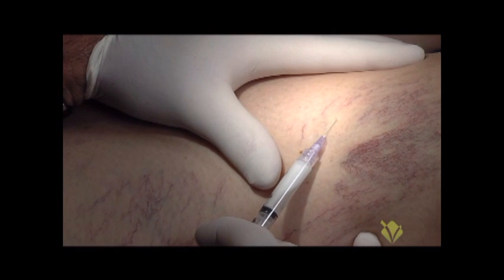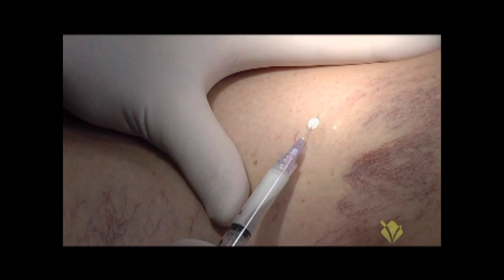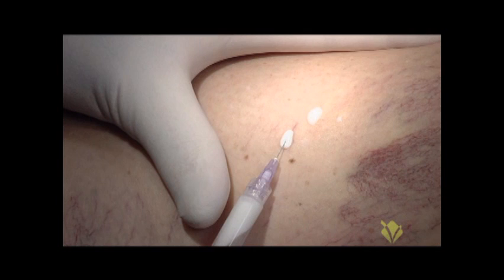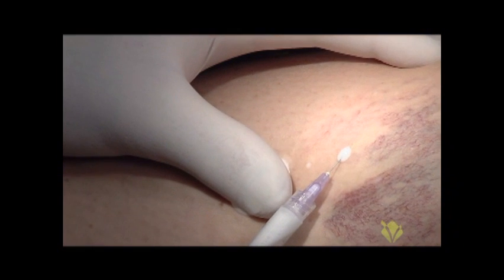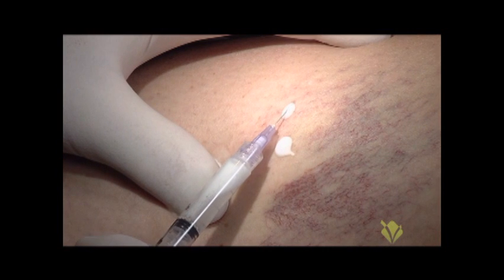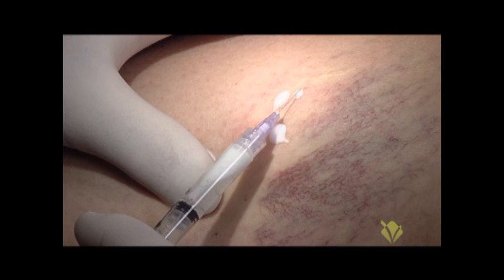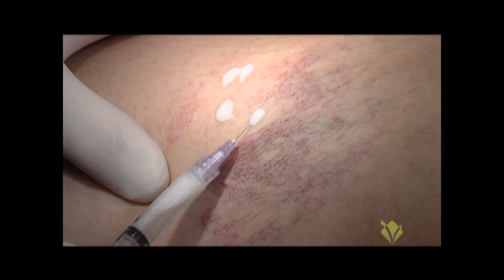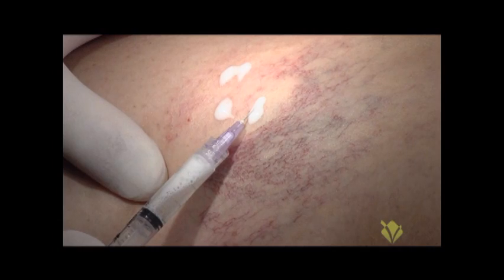You can see how that medicine is clearing the veins. She's burning a little bit — probably a little discomfort. I'm just working my way down until I've cleared the whole area of interest. I'm not using a lot of pressure. Since we're not injecting into the dermis but into the veins, there shouldn't be as much pain as putting in xylocaine, but there will be some burning in the skin from the medicine in the small veins.